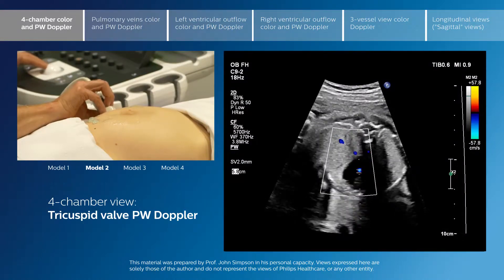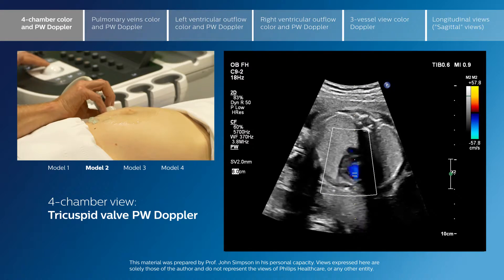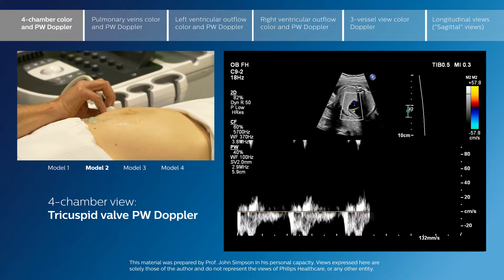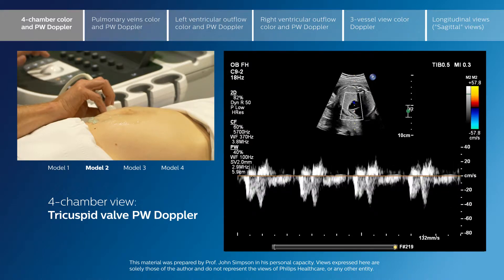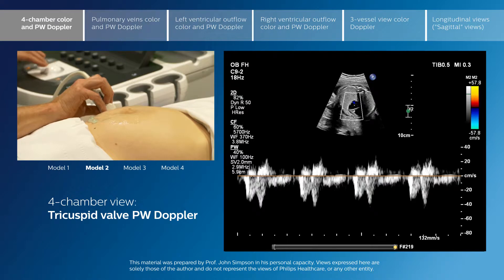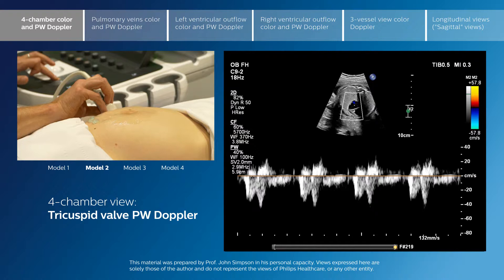Looking at the tricuspid valve inflow signal, we see similar findings to the mitral valve. There is dominance of the A wave compared to the early E wave, which is normal in the fetal circulation. We should see a biphasic pattern, meaning both the E and A waves are clearly separate across each of the AV valves. To see a single spike of inflow across either AV valve in the normal fetal heart should raise concerns that there may be an underlying structural or functional problem affecting the fetal heart.